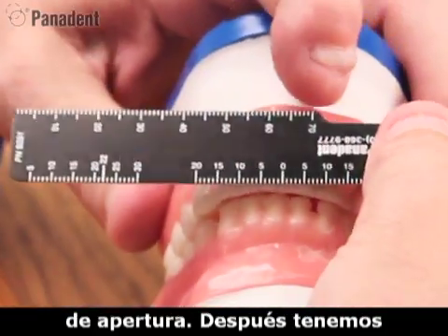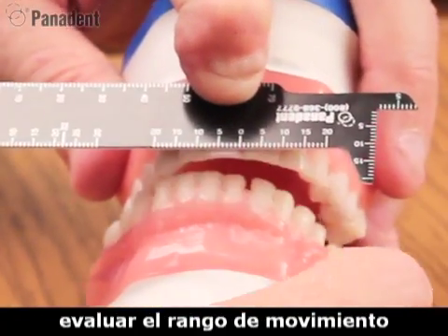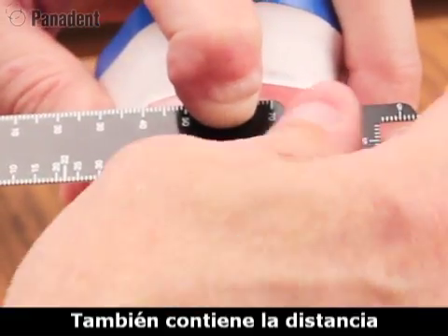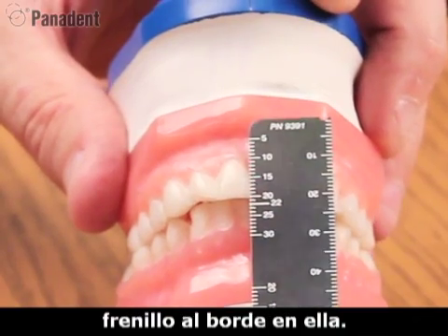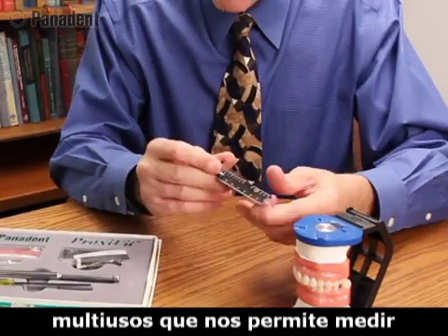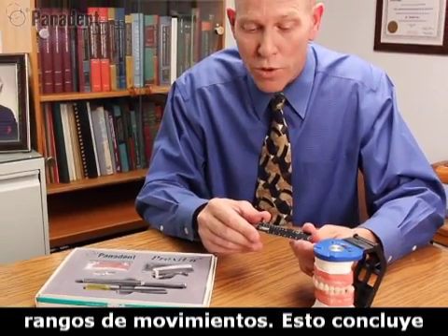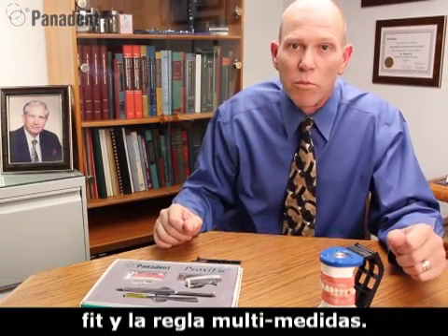There's a horizontal scale built into it as well, so we can evaluate horizontal range of motion. It also has the frenum to incisal edge 22mm distance built into it. So it's a multi-measuring ruler for measuring tooth widths, tooth lengths, overbite, overjet, and range of motion. That concludes my presentation on the ProxyFit module and the multi-measuring ruler. Thank you.